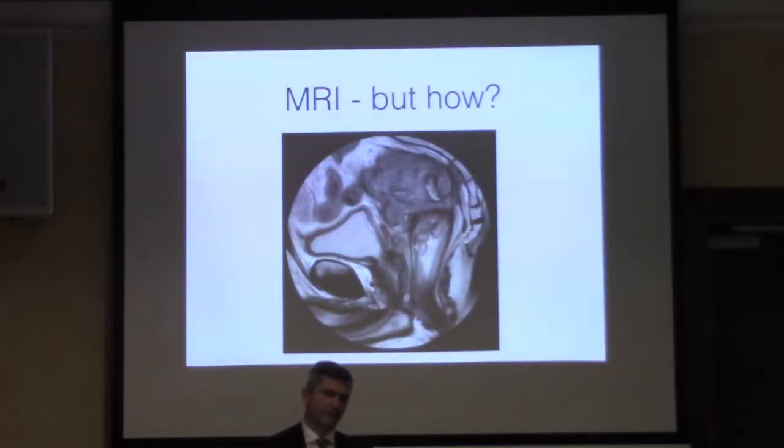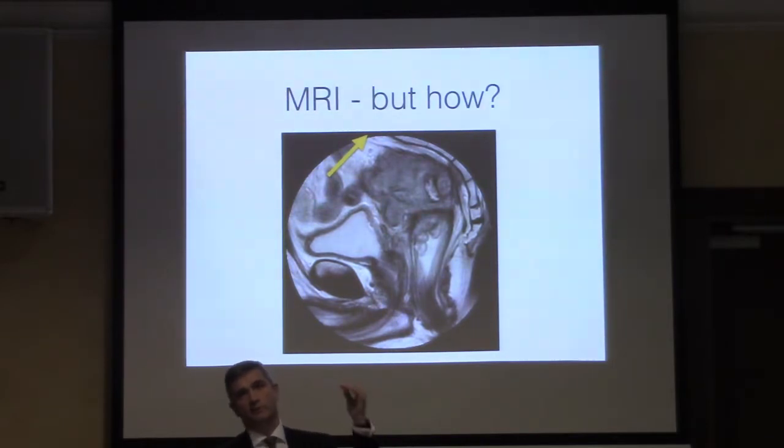This is a small field of view which is supposed to reduce the potential artifact from anterior abdominal wall movement, which it does. The downside is that you can't see the lumbosacral junction, so for purposes of guiding radiotherapy and high nodes involved, you can't include it. Equally, we can't confidently see the external anal verge, which we use as our marker for where the tumour is. So make sure that the scans that are being done allow you to provide the information which you require to do a proper report. So narrow field of view isn't going to work.